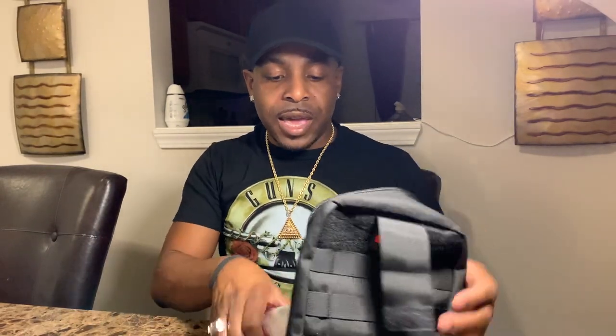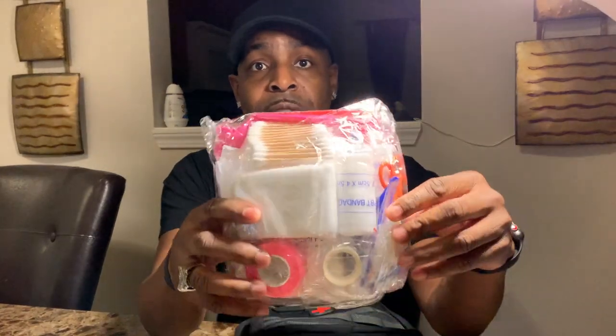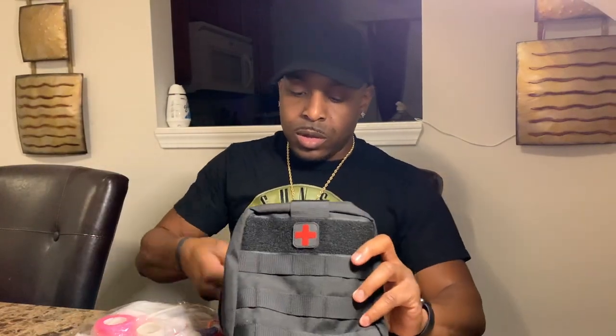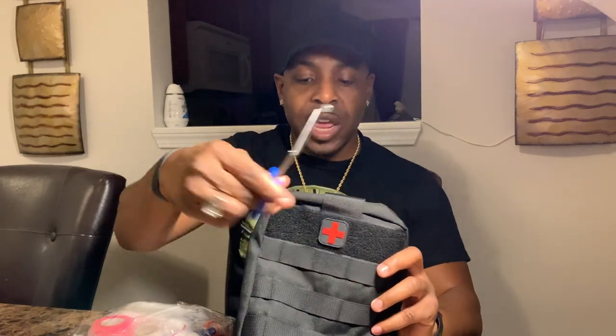Here are the contents inside the bag. I'll give you an overview of all the content items and name all of them towards the end of the video. Stay tuned — I'll mention these in a few minutes.